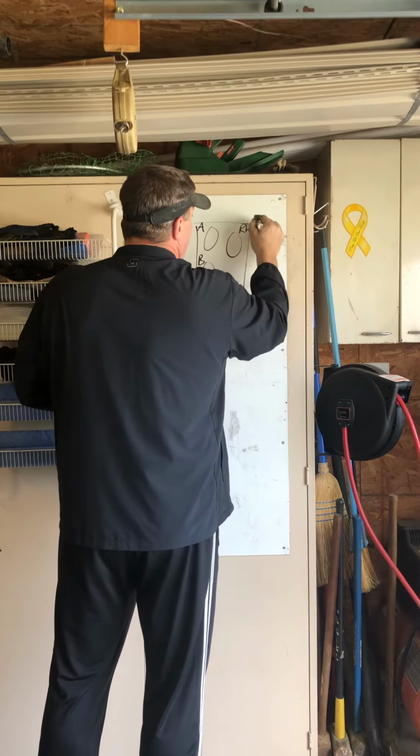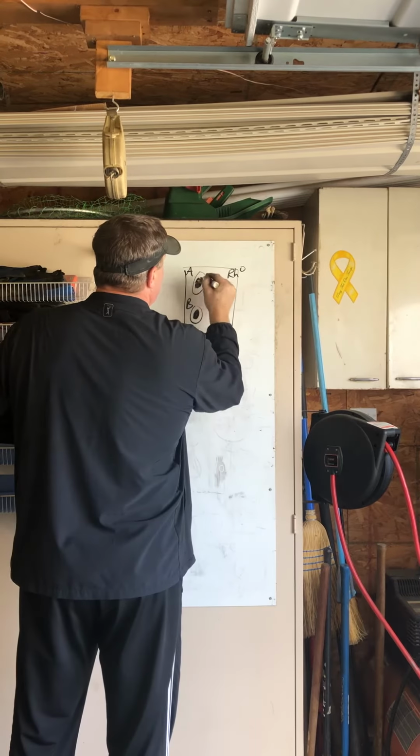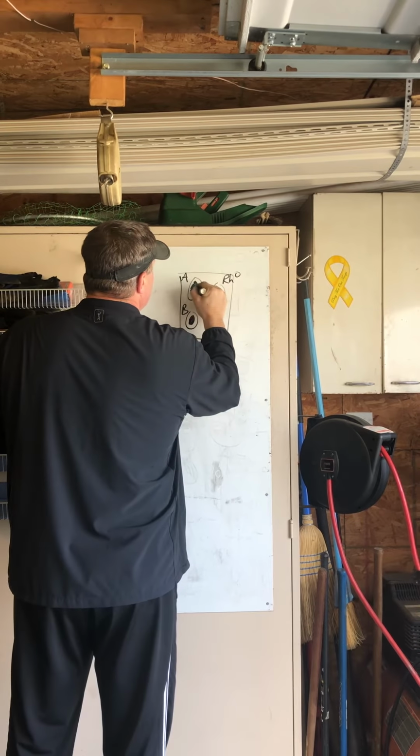So when we do the blood typing, if it clumps, let's just do it like this. This is not red, but if it clumps in the plate, and you'll see it, it'll have like little white specks. I'm having a hard time doing that with this. Let me get my other marker out here. The blue is going to stand for clumping, if you can see this.